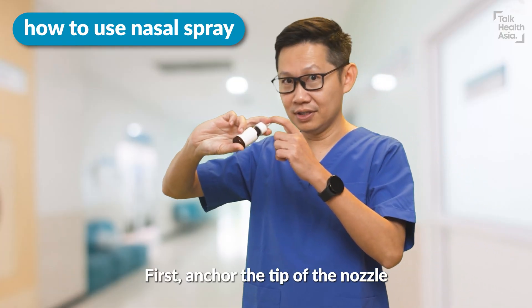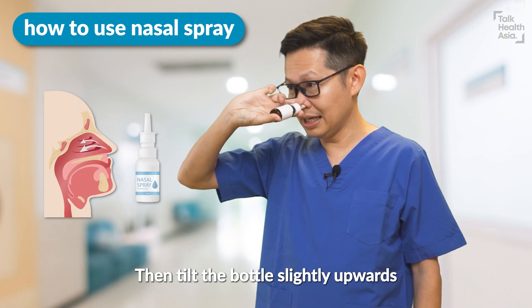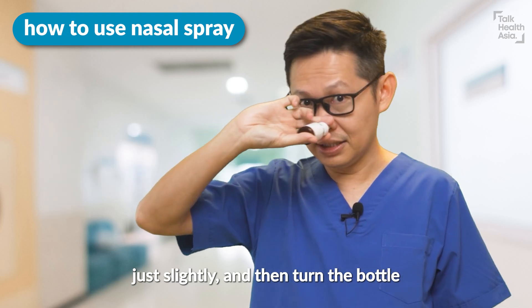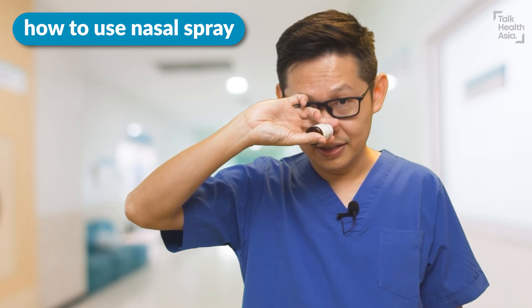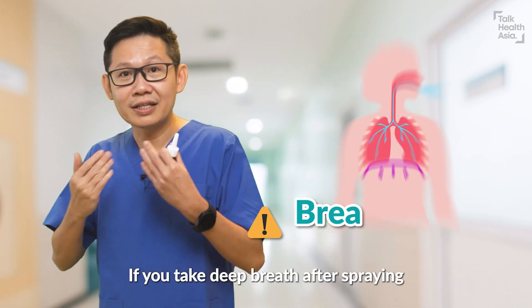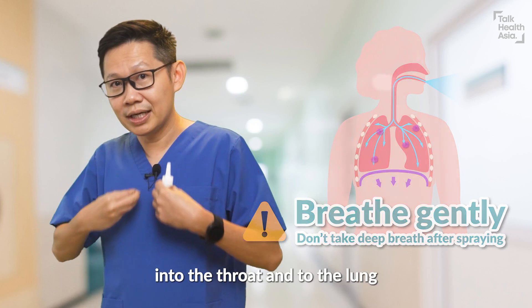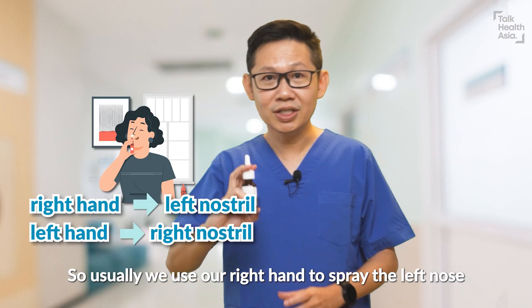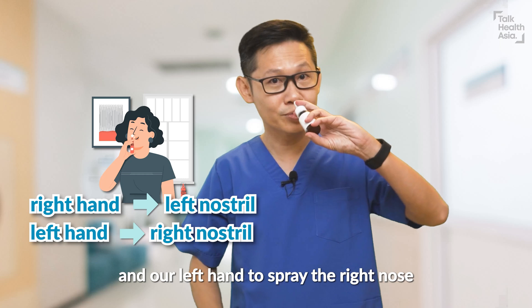Anchor the tip of the nozzle at the upper part of the nose, then tilt the bottle slightly upward — just slightly — and then turn the bottle slightly to the side. Then head down and press. If you take a deep breath after the spray, all the medicine will go directly into the throat and to the lung. We want the medicine to stay in the nose. So usually we use our right hand to spray the left nose, and our left hand to spray the right nose.